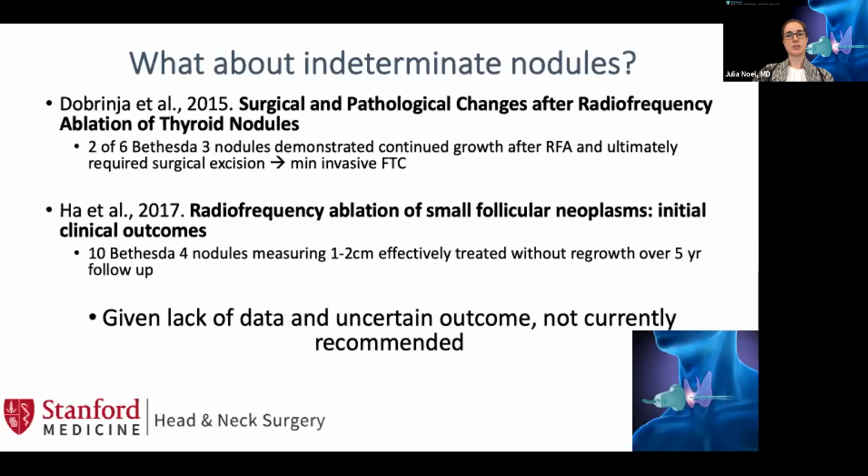Indeterminate nodules, I'll touch on briefly. They do represent a bit of a knowledge gap in radiofrequency ablation. The limited data we have is mixed. So you'll see in this first study from 2015, of 6 nodules that were classified as Bethesda 3 that were treated with RFA, 2 continued to grow and ultimately required surgical excision, after which they were diagnosed as minimally invasive follicular carcinomas. The second study by Ha et al.